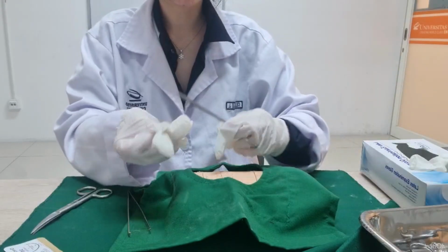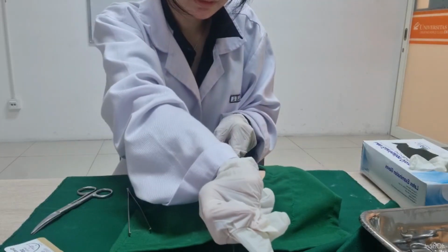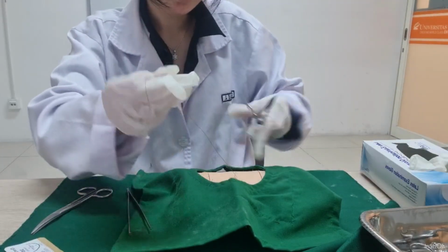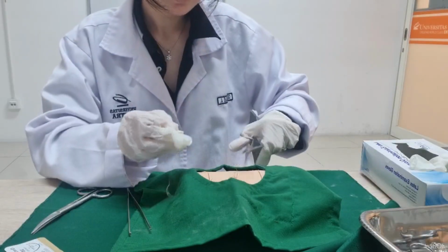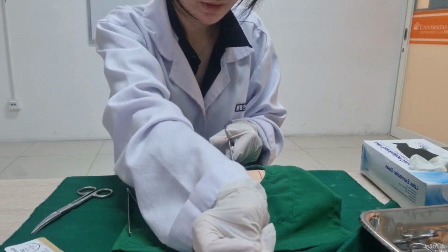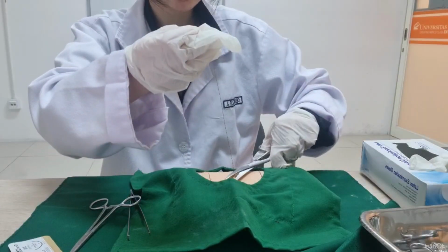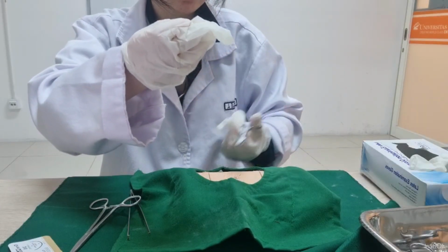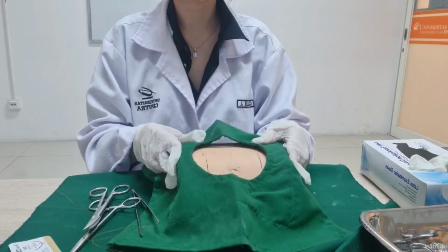Next, I will tie a double knot like before and tie the suture. To ensure extra safety so that the suture will hold, I will tie another knot. Okay, so we're done with the simple interrupted suture and I will cut the extra suture. Okay, so that is all for the simple interrupted suture.